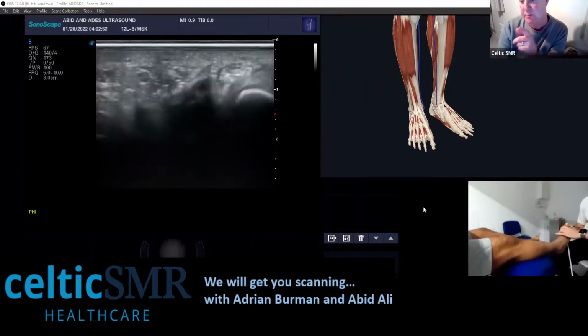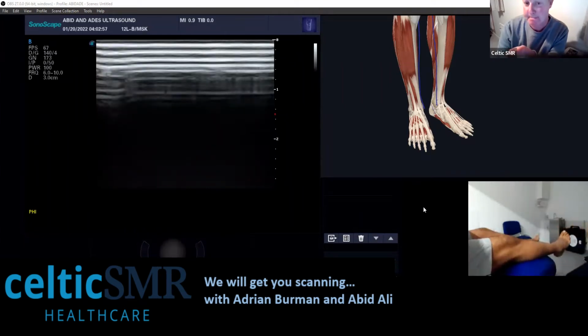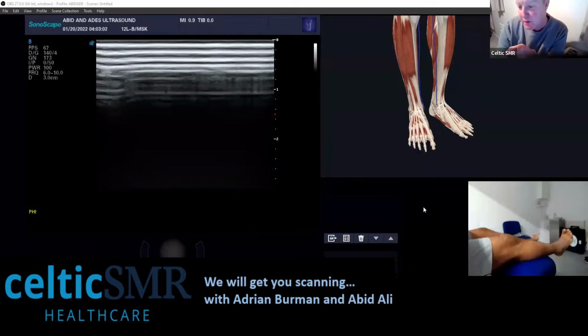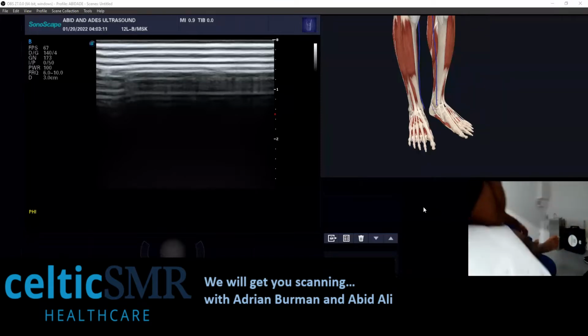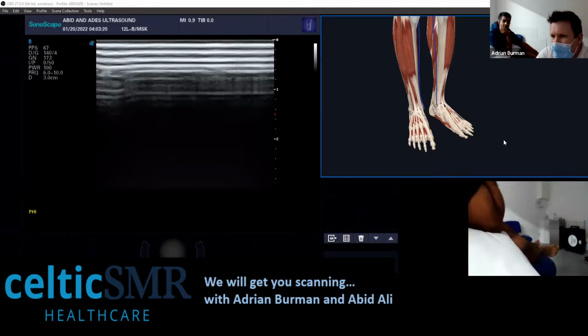I've got another question from Sandra, which we'll come to, but Zoe, are you still there? Thanks, Adrian. You're welcome. Zoe has asked a question here, so do you want to ask it now while you're there? Yeah, basically I'm doing my mentoring at the moment and it's all going really well, apart from I just want some clarification on assessing the medial ankle structures, the retinaculum and the tibial nerve, and being able to chase the tibial nerve down a little bit as well, if we're assessing tarsal tunnel.